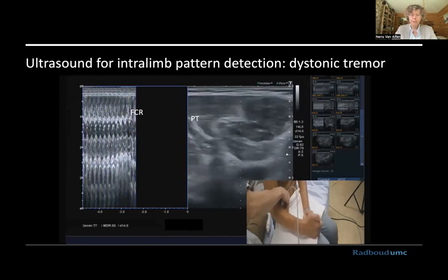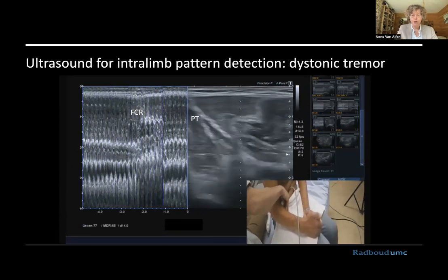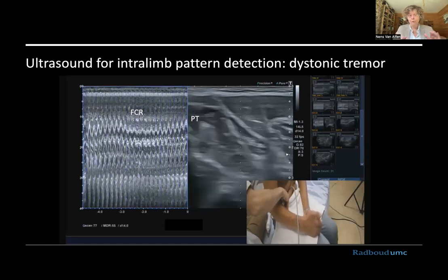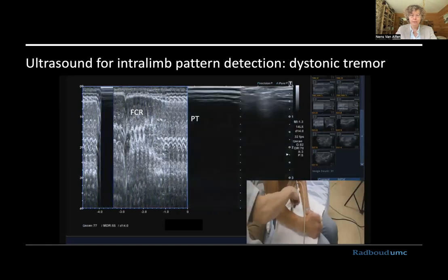Okay, so here you see we turn the M line on, and then you get just a single image line, which is the dots that go vertical in the right-sided image. And so FCR is overlying this. Sorry, I couldn't get rid of that. But you actually see the pixels moving in that single image line.